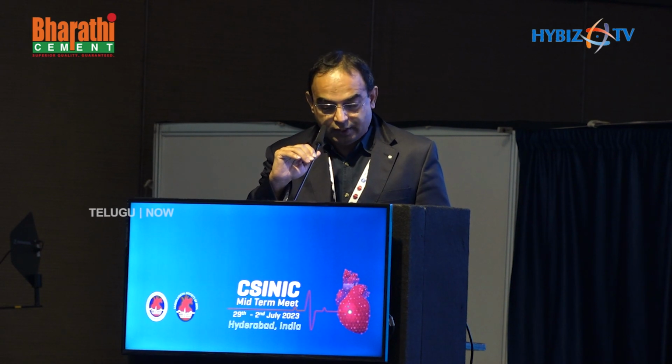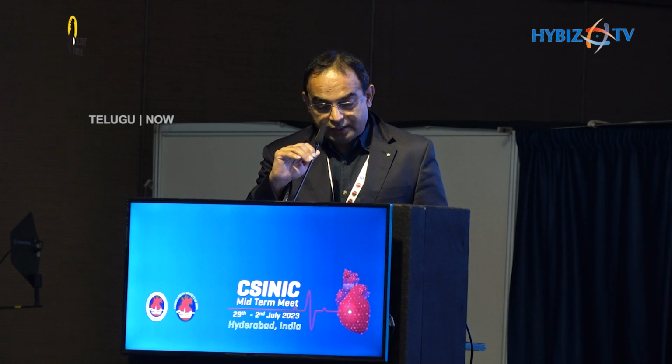But since this was a dominant circumflex, we went ahead and did a side branch strut opening followed by a kissing balloon dilatation. The new imaging modalities, especially the OCT-based ones like 3D reconstruction, 3D navigation and fly-through mode, are very, very useful when we are doing bifurcation stenting or want to see the side branch MSAs and whether our wire has passed from the proximal or distal stent. These are very useful advanced techniques in OCT to assess complex bifurcations and bifurcation techniques. Thank you very much.